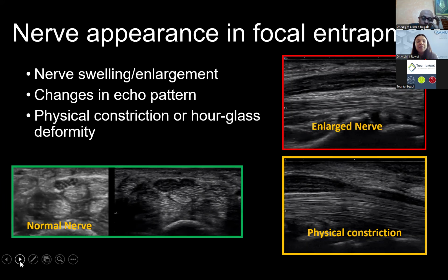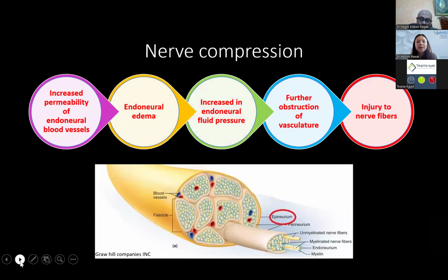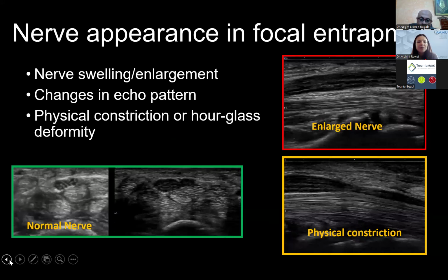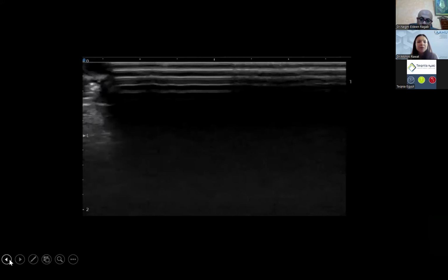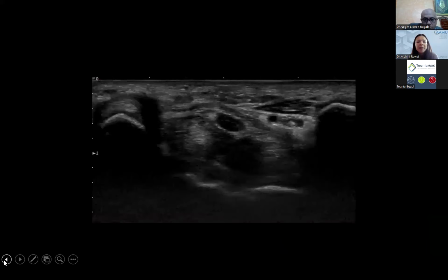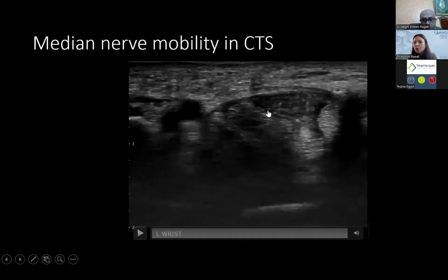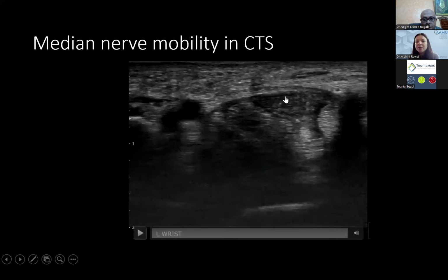So when we looked at the example, I think that was previous before this. The nerve mobility speaks to that same feature. When a nerve becomes stiff, it does not move very well. So this would translate to elastography. If you have the elastography feature available and you look at it, you will see the nerve tissue will show as a hard tissue.